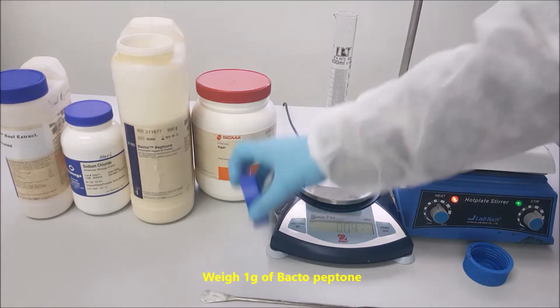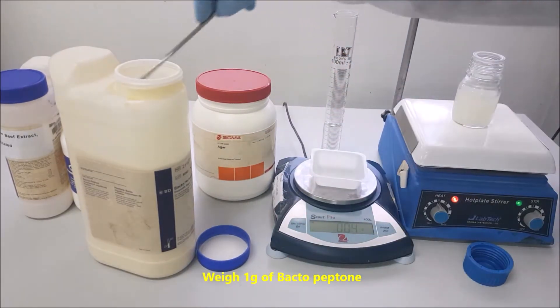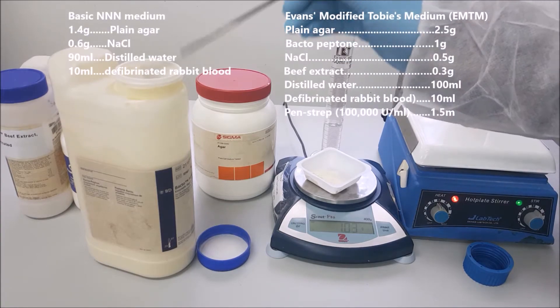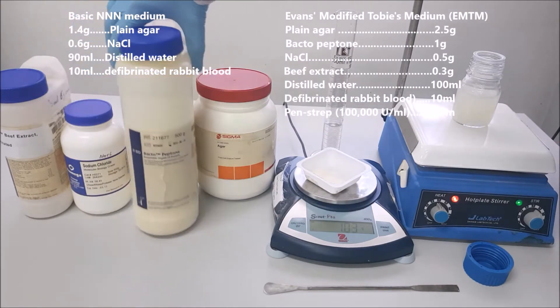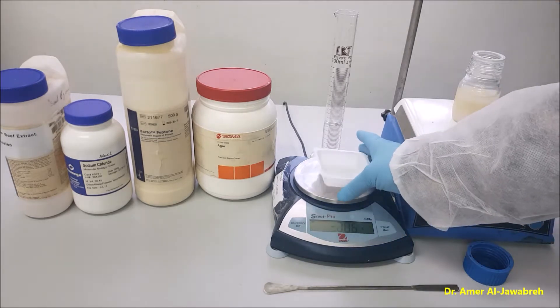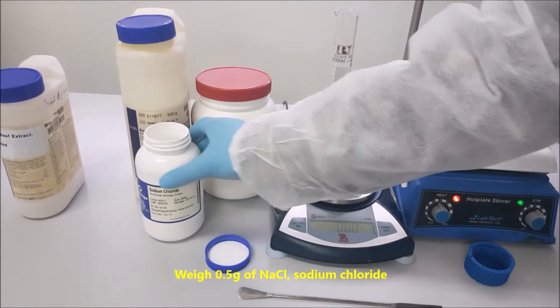Weigh 1 gram of bacterio peptone. Add bacterio peptone slowly while stirring. Weigh 0.5 gram of NaCl — sodium chloride.